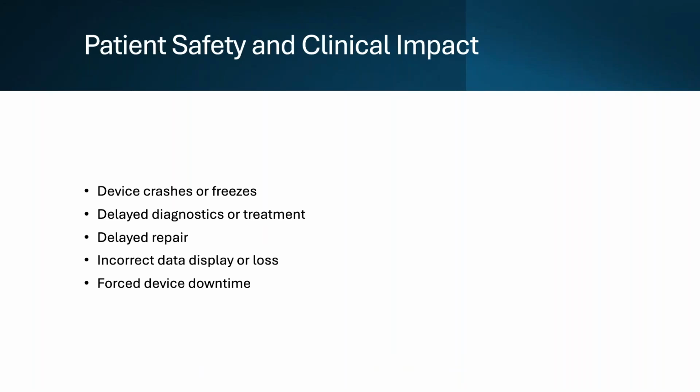Patient safety and clinical impact. The risks extend directly to patient safety. Operating system failures can cause device crashes or freezes during critical procedures. Imagine a ventilator or infusion pump freezing during patient care. The consequences could be life-threatening.